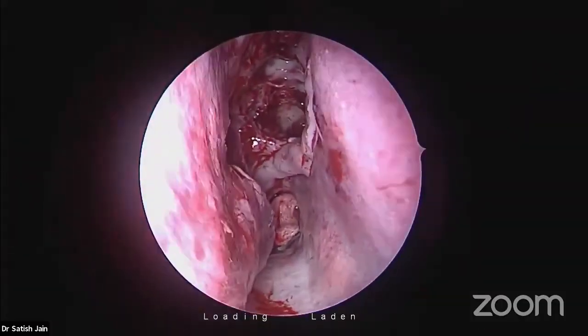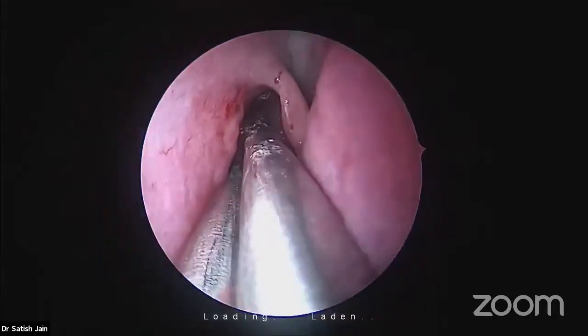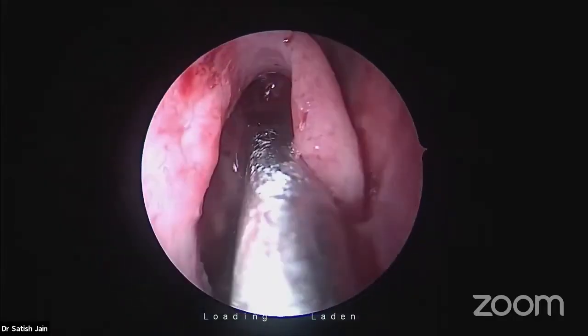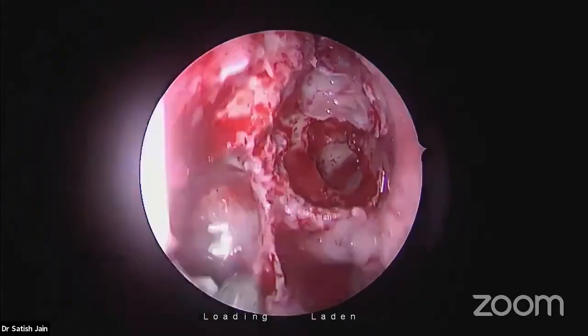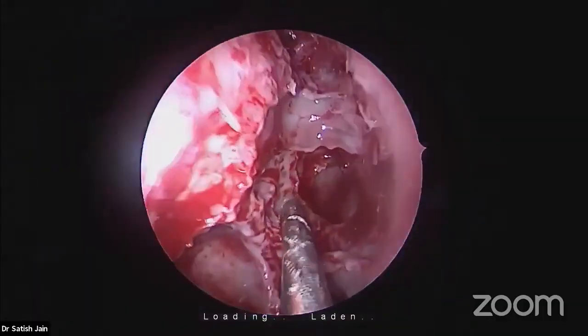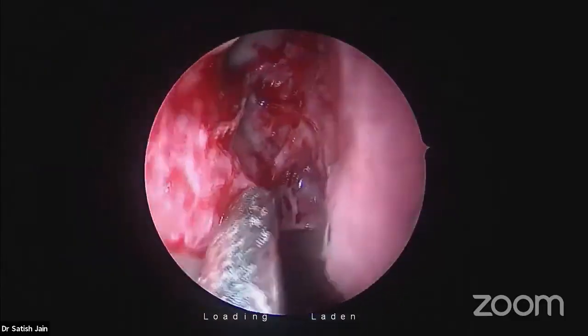And if you happen to damage it, you may have to do a partial resection or something like that. Sir, could you tell conditions in which you at times would like to cut the partial part of middle turbinate? Yeah, many a time. Huge AFRS, massive mucosal disease, we do it intentionally, for better delivery of steroid. No question of blocking it further.